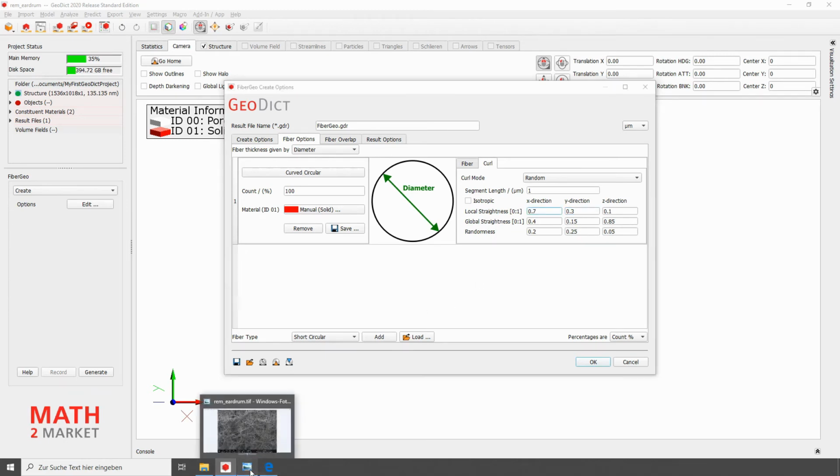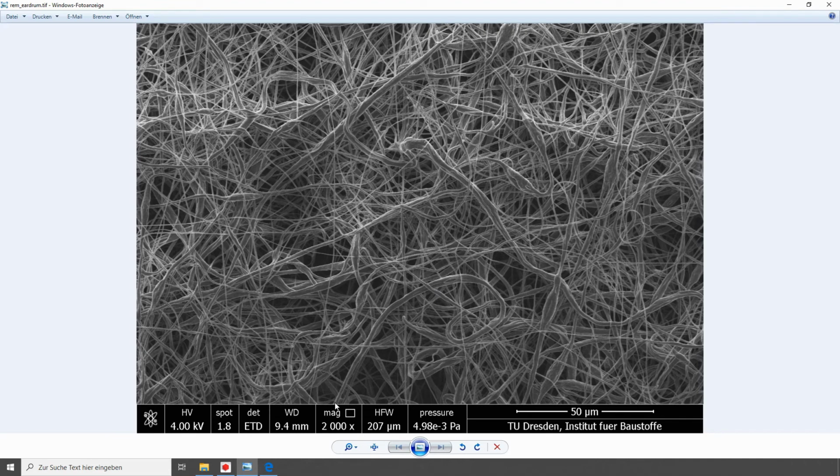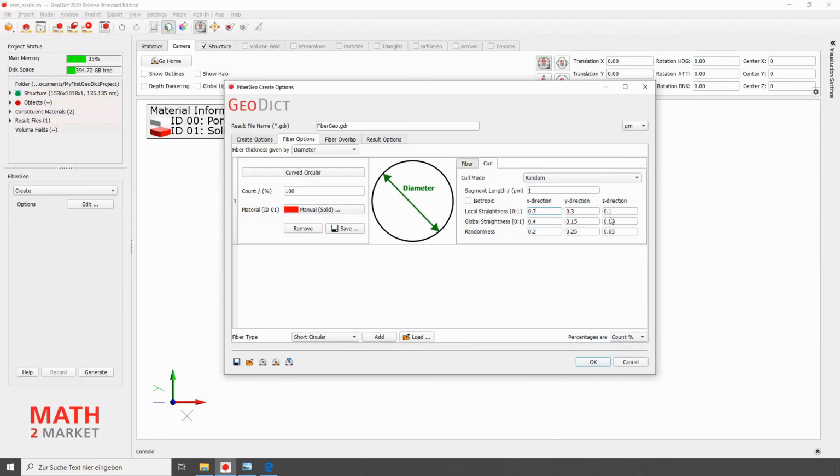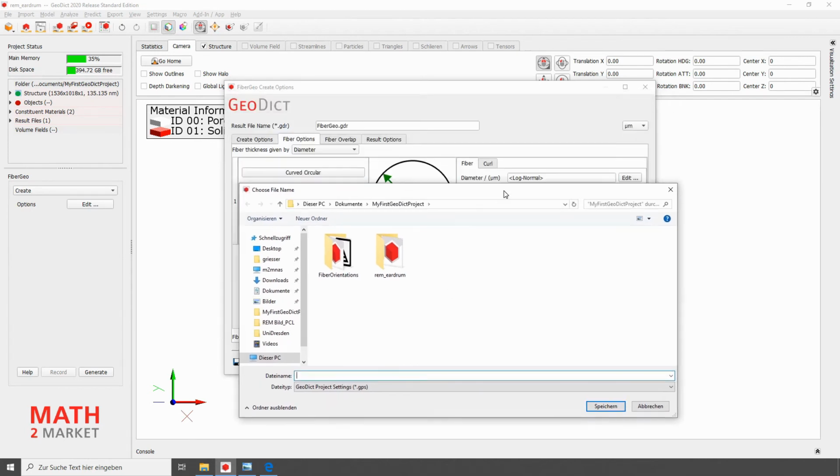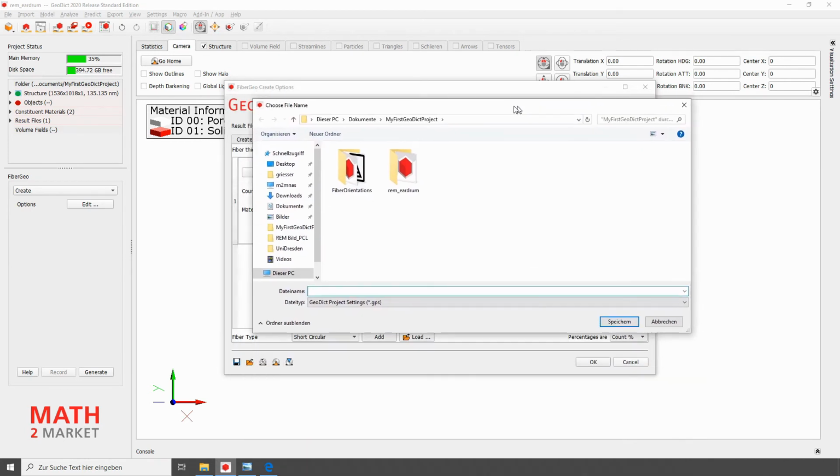This assumption is based on the fact that when we look at the SEM image again, we often see straight fiber areas, which then turn into a bend and then continue straight again. Such a behavior can be easily modeled by such a choice of parameters. Now, all parameters for our fiber type are defined and we want to save it. Therefore, we click on Save and choose a name, for example, Eardrum Type 1.